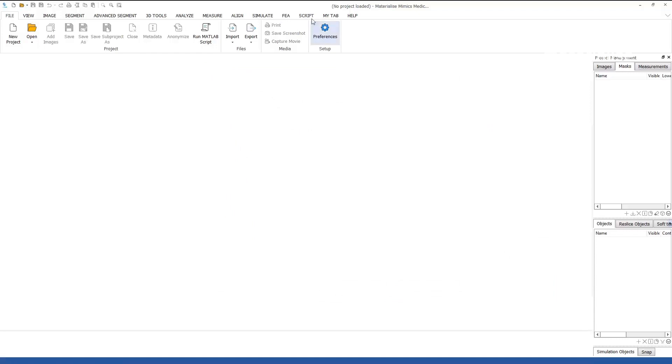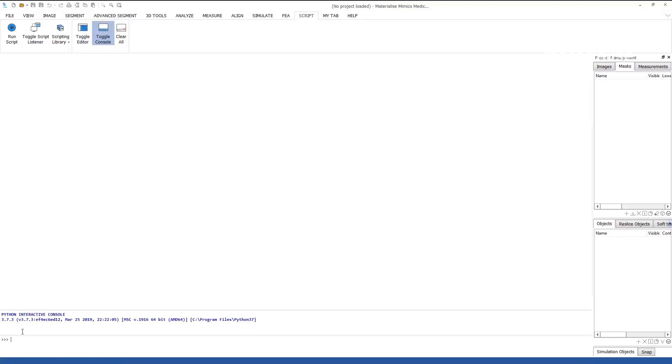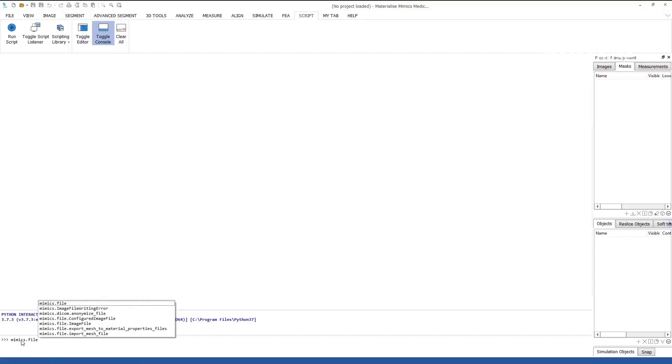Next, go to the Script tab and activate the toggle console. You can now test the scripting functionality in Mimics with the demo files available in the Mimics installation folder.